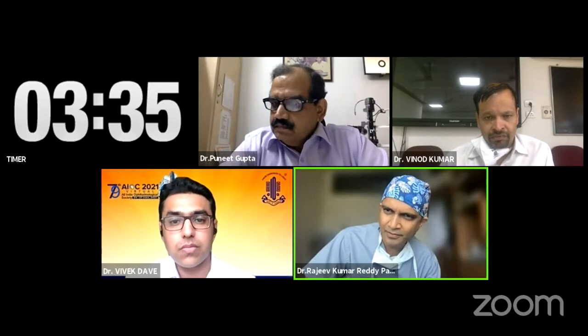So before going into the endophthalmitis, how often did you feel, when you are doing vitrectomy using an endoscope, that you are seeing more exudates than what you usually used to see when you are doing a regular vitrectomy?